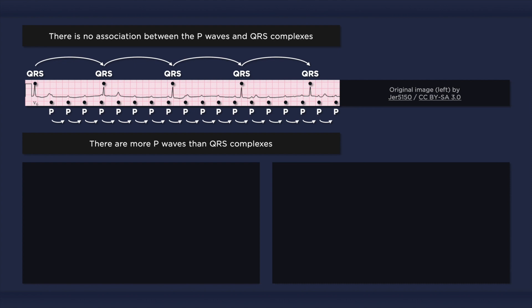In this rhythm strip, you may have noticed that the QRS complex is rather narrow. Well, the morphology of the QRS complexes and the ventricular rate depends on the location of the escape pacemaker.